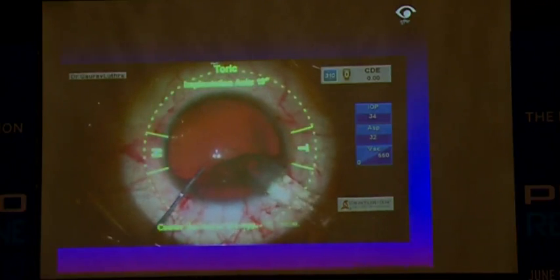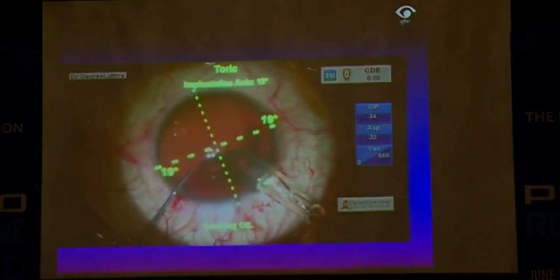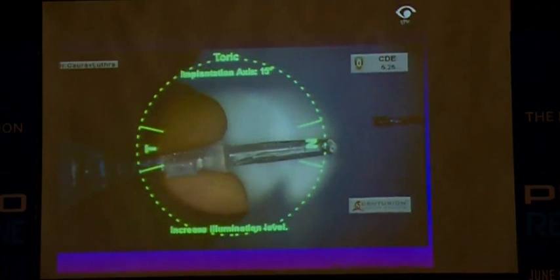If that happens, usually you will have an aborted injection because the ICL would have twisted or turned and it won't come out the correct way. So again, you are in a situation where you don't want to be. Please be careful when you look at it under the microscope that there is no projection from the smallest of the tips in front.